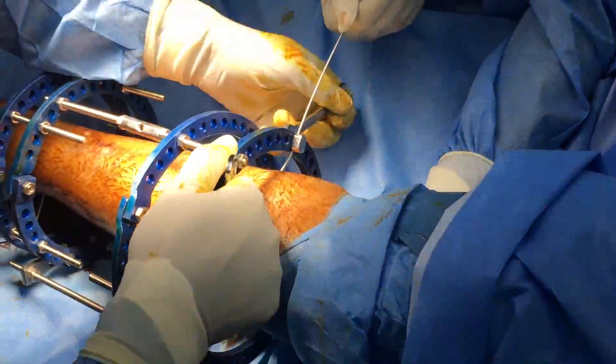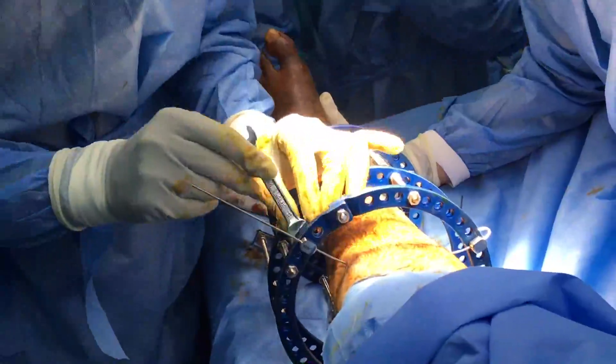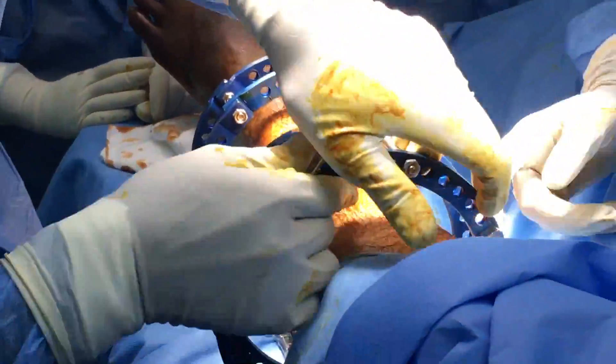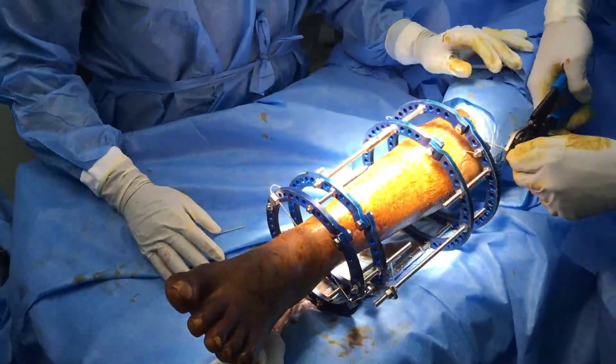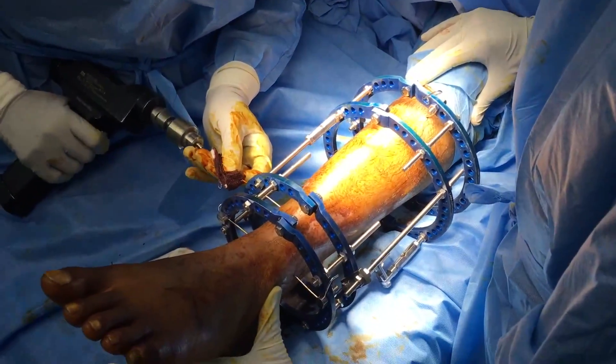The next step is tensioning of the proximal wire in which the bolt is tightened on the nut. As we twist the nut, the wire gets tensioned and once again resonates as the distal wire.